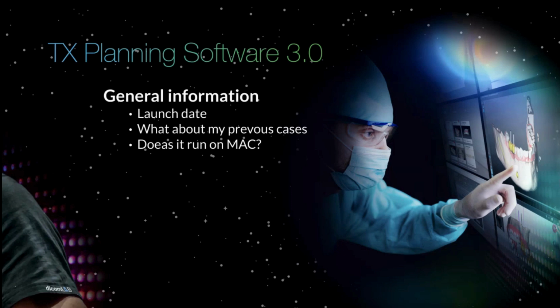Of course, all your previous cases you can find in the cloud platform, and they will still continue to open in the old version of the software. So don't be afraid, you will see all your previous cases. The only thing is that you need your old computer, or the other computer where that software is running, in order to open them.